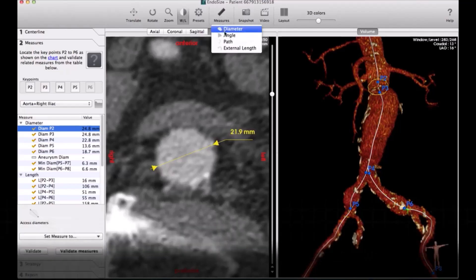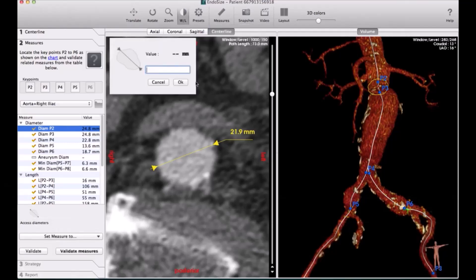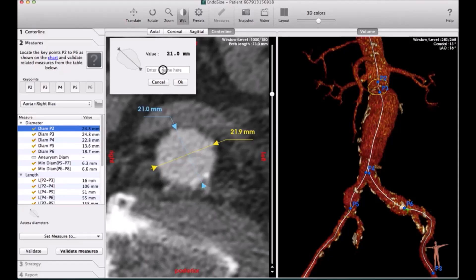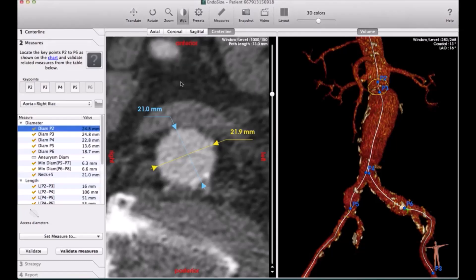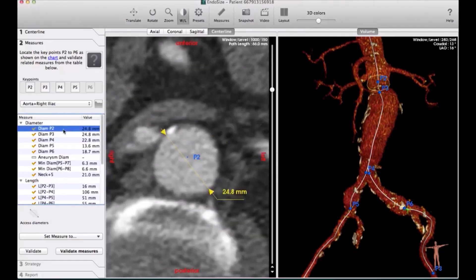Here is confirming the measurements that has been done by EndoSize. Once you confirm it and you are happy, you go to the step after that, which is do the sizing report. Very professional sizing report.